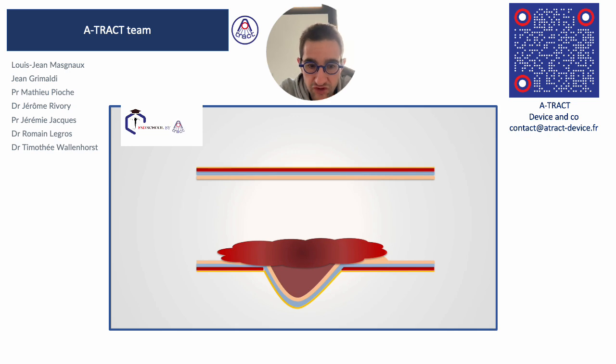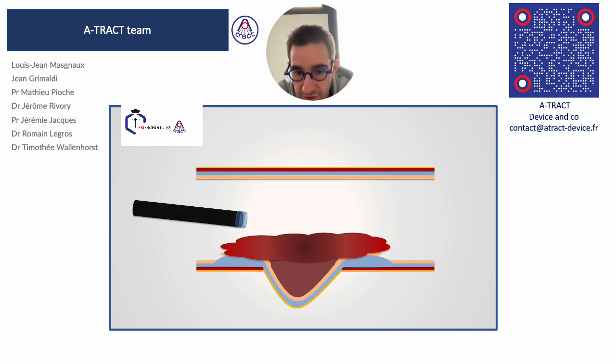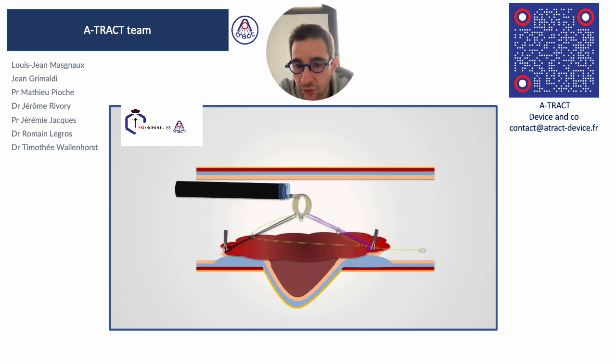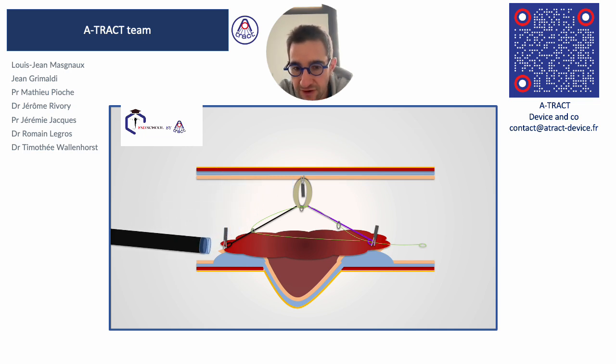Thank you very much, and to finish, this small reminder of the strategy: circumferential incision, multipolar adaptive traction, strong traction, circular dissection all around the diverticula to remove the submucosa that reduces the tension and the traction in the middle of the diverticula.